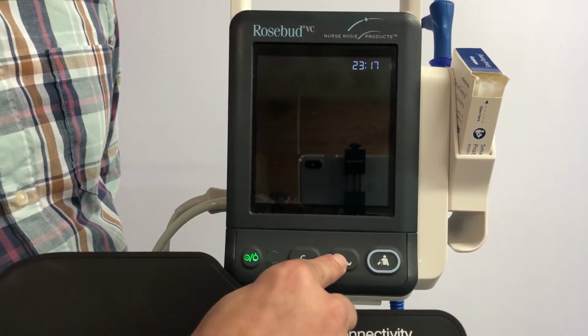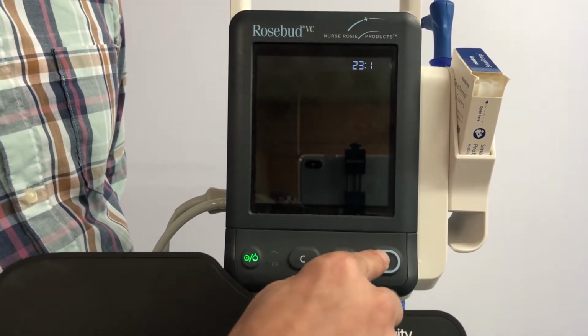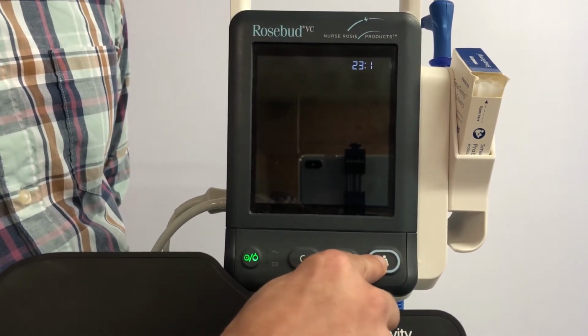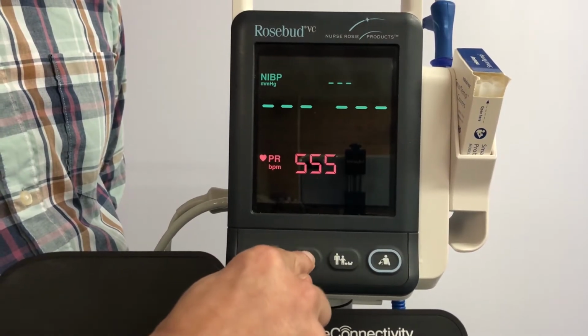When you're in the time settings, you can use the adult, child, infant button to cycle between different digits of the time, and the blue blood pressure button to change the value of those digits. When you have set the time correctly, press C 5 more times.